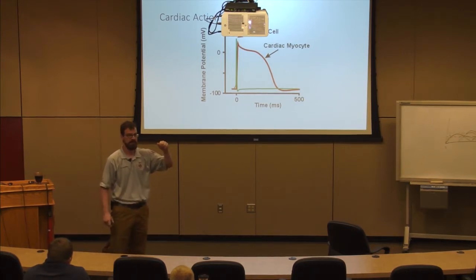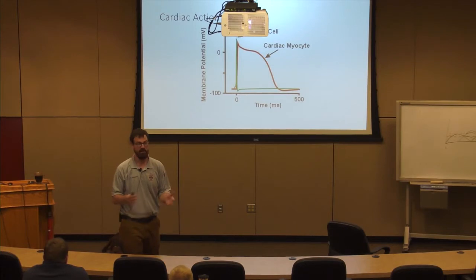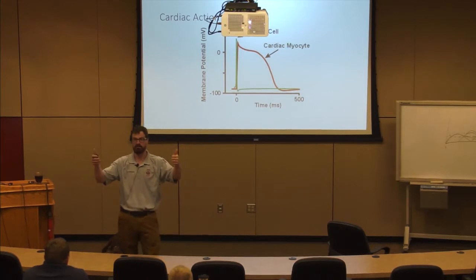If I have a guy who is seizing, or I get called to a seizure and I notice that they have a wide QRS and run VTach, I'm thinking sodium channel blockers, right? I'm thinking sodium abnormality, low sodium, or sodium channel blockade. That's the classic manifestation of severe tricyclic overdose: seizures and VTach, okay?